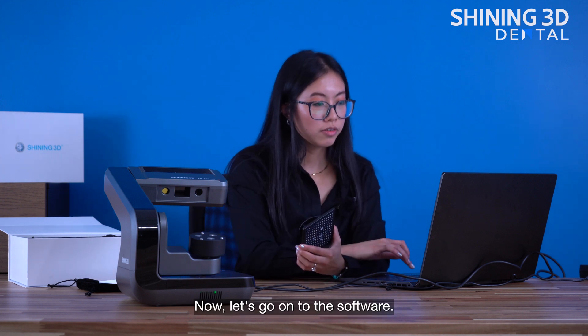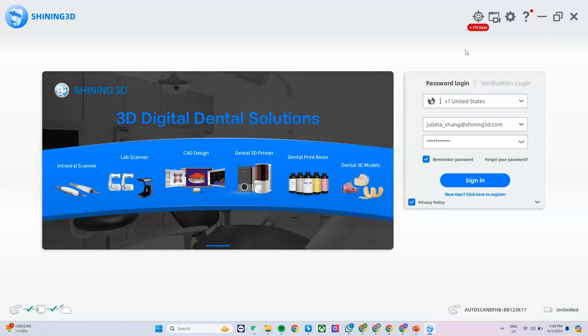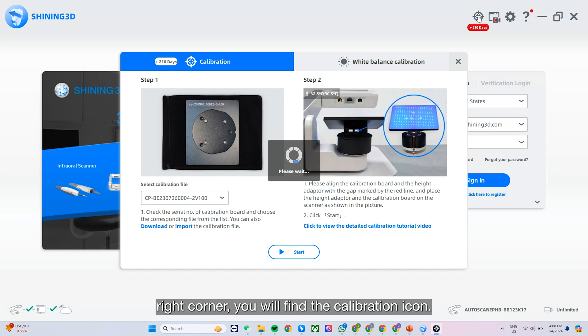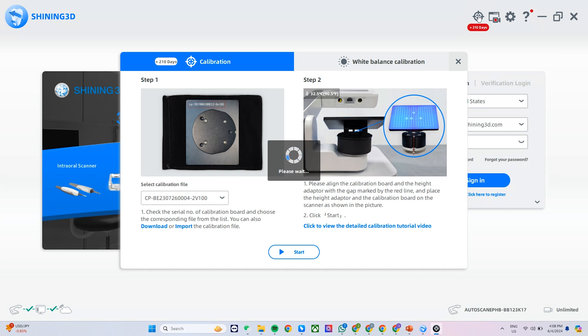Now let's go on to the software, and once you are inside the software, on the top right corner you'll find the calibration icon. Let's click on this icon.